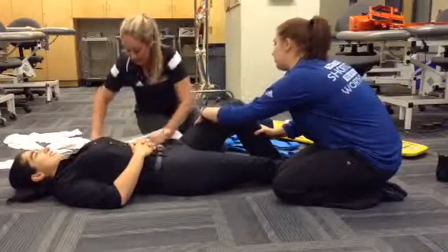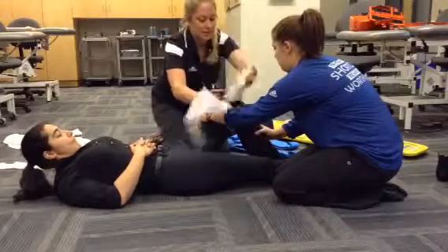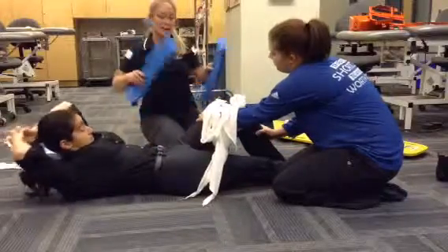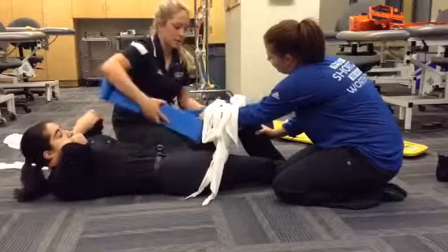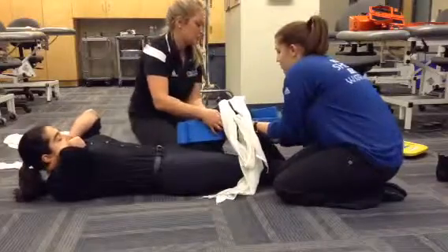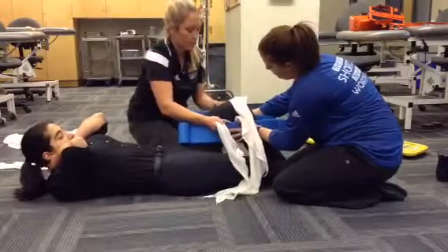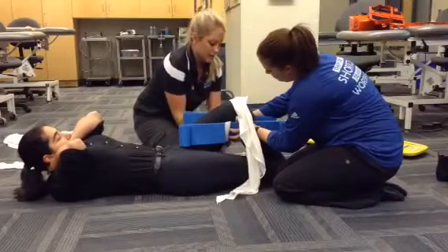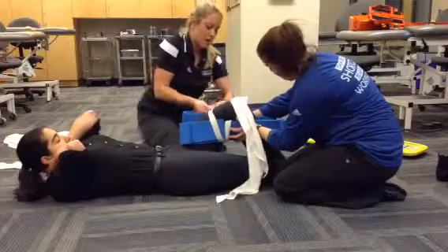The first thing we're going to do is put in two bandages. Next we're going to use two doubled-up SAM splints to stabilize the joint above and below. The first one is going to come underneath and over top, tying on the outside.